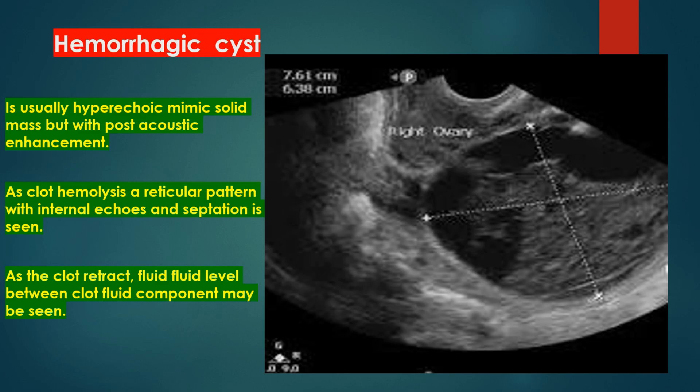Hemorrhagic cysts are usually hyperechoic and can mimic a solid mass, but with posterior acoustic enhancement. As clot hemolysis occurs, a reticular pattern with internal echoes and septation is seen. As the clot retracts, a fluid-fluid level between clot and fluid components may be seen.